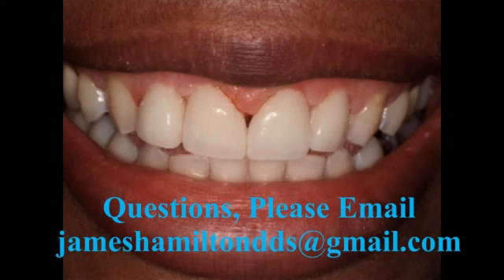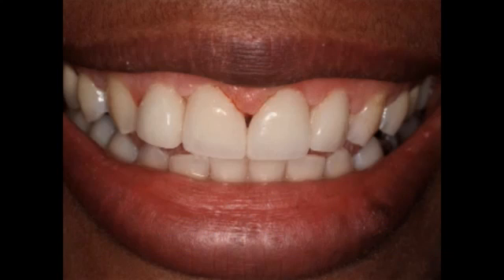Yeah, got you. Okay. Those composite veneers were held on mechanically because when I forced the impression to place, some of the composite in that impression went beyond the height of contour in a buccal lingual direction. When I cured that from the lingual, it mechanically locked on those composite veneers. Then when the patient comes back 2 weeks later, I take a sickle scaler and I break those veneers off. They came off in about 3 pieces because they're only about 1 millimeter thick. And so the composite is not difficult to break. I was able to break that off with a sickle scaler and put on my veneers. So they were not held in place with bonded composite.